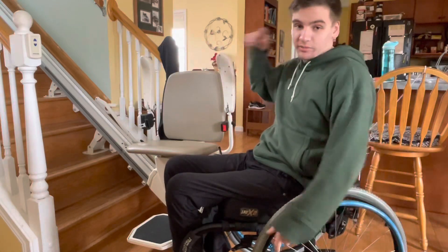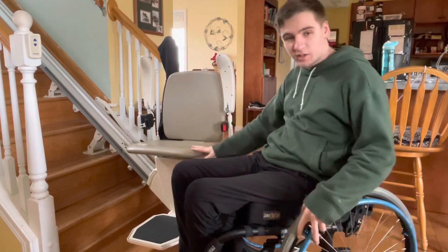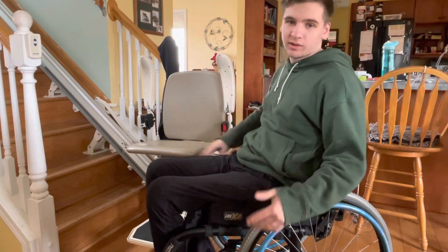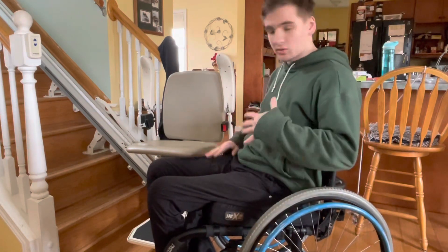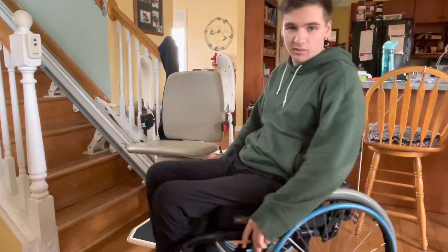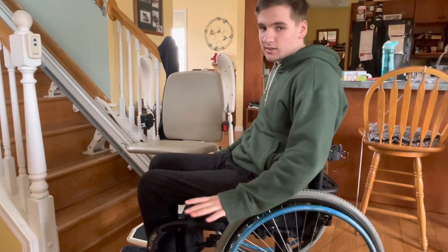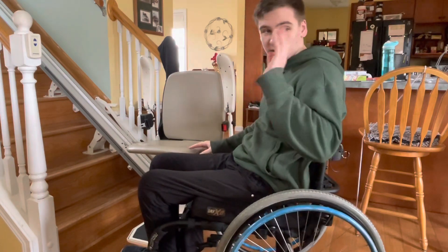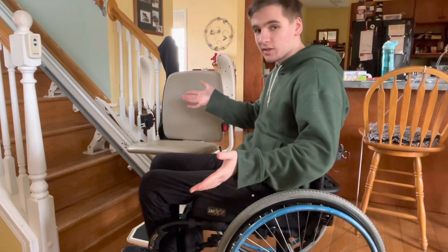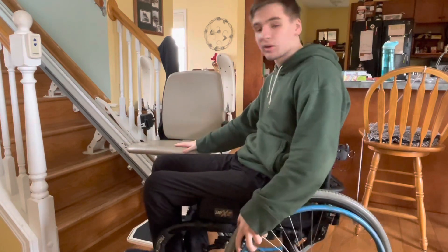How to do a transfer. I have right here a chair lift to help me get up the stairs — I'll make a separate video more about this — but how to transfer into one of these, or basically onto anything. Any surface that's about the same level as your chair is pretty easy to get into, and the biggest mistake or thing that people misunderstand is how to position your chair with the thing you're transferring onto.